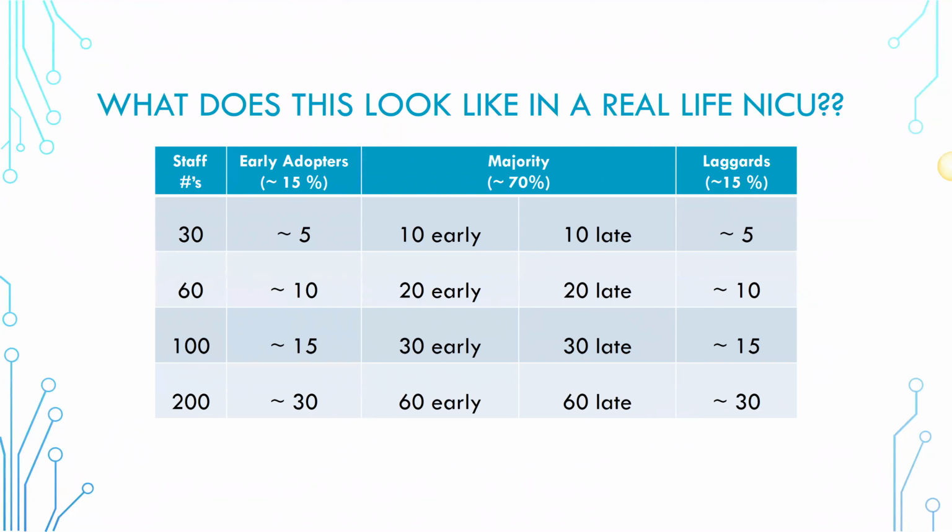All right, so let's do a quick backtrack and make sure we're all speaking the same language, and talk a little bit about what aEEG, or amplitude integrated EEG, is and what it isn't. Basically, for the bedside brain monitor using aEEG, it's really that complementary tool. We use it in conjunction with other assessment tools, and it's not meant to replace other things, but to augment what we see in real time with our physical exam, but also some of the individual discrete tests that we do.